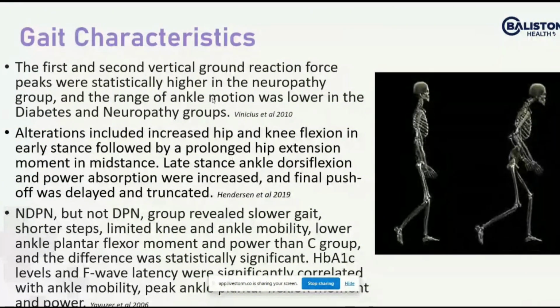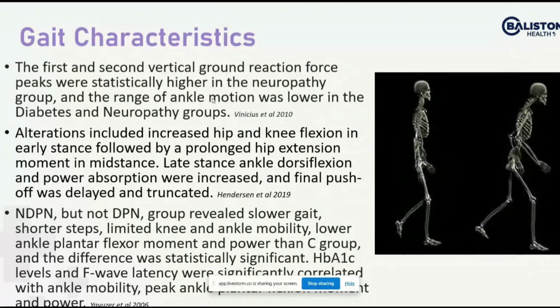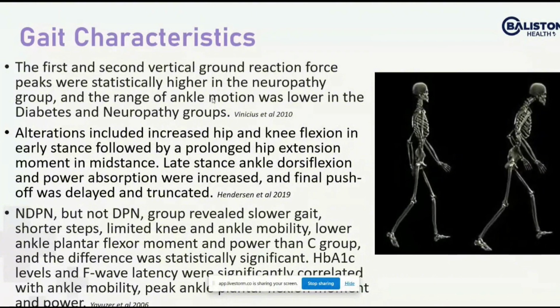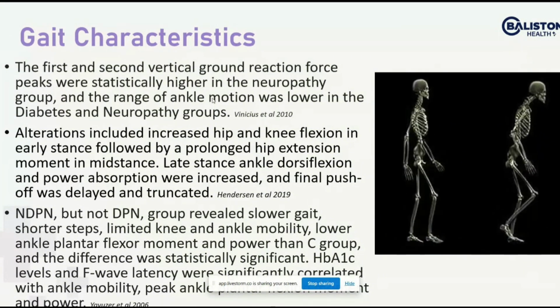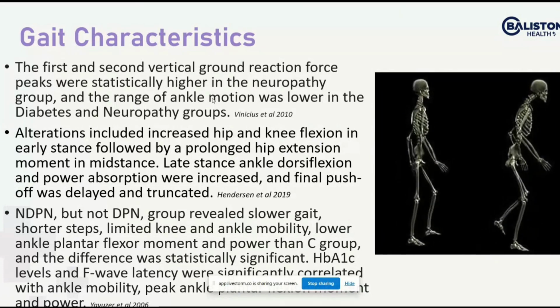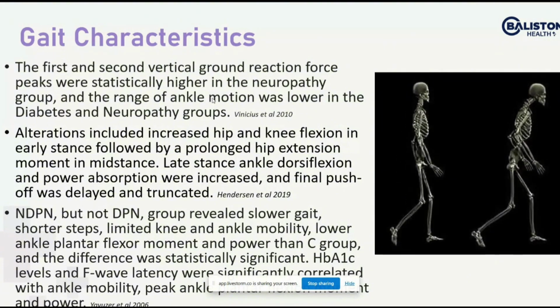And because we see an increase in hip and knee flexion, that's also when we look at the spatial orientation of how high they take their steps. It's a process, and so there's going to be some changes, and then other things are not necessarily going to change just yet. What's interesting is we consistently also see ankle range of motion, so in dorsiflexion and plantar flexion, begins to change.